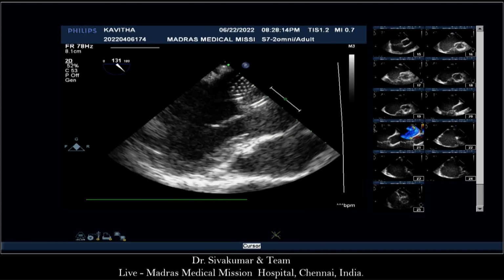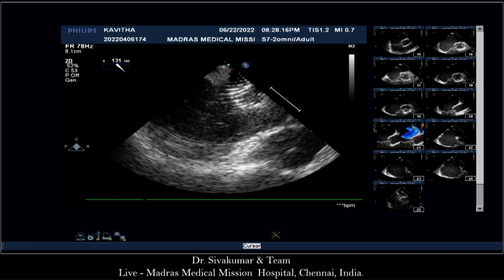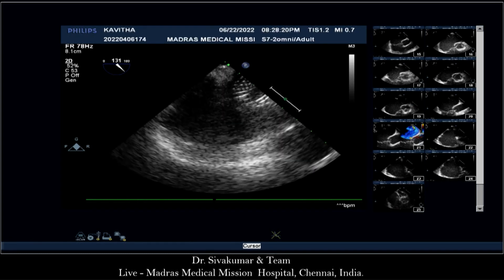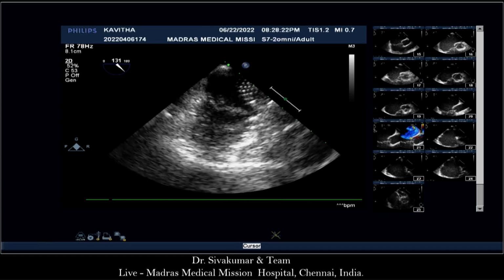Shaq, you are conducting an echocardiogram exam for me. Yeah. You didn't think I could do this. Okay.